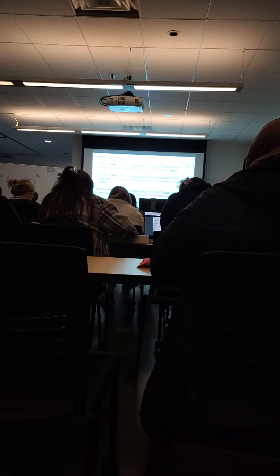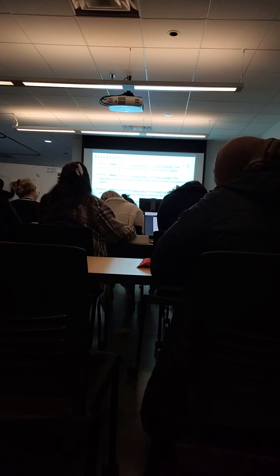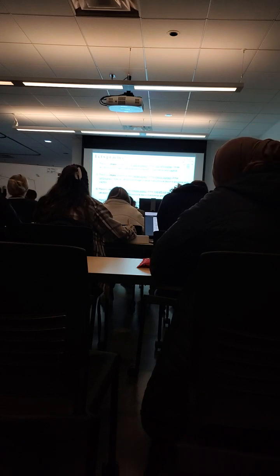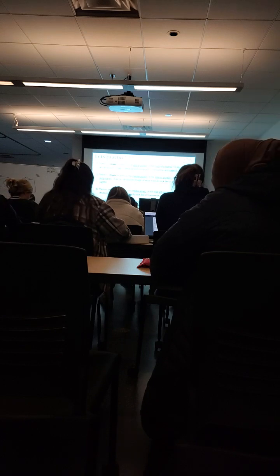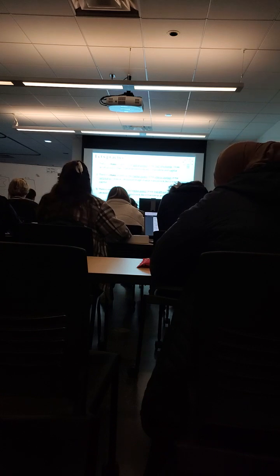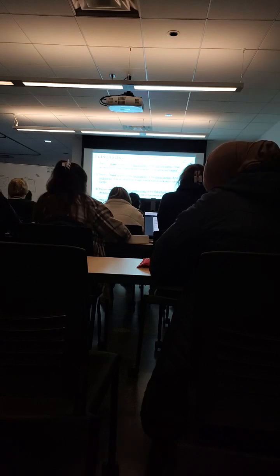What's this gonna be? Right lateral. What's this gonna be? And I already know that it's gonna look like this. That's my way of drawing. So there's a mass located on the lateral aspect, so we're lateral, somewhere here, of the mid-right kidney. So that means this thing has to say right kidney, transverse, mid. Because we're either superior, mid, or inferior.